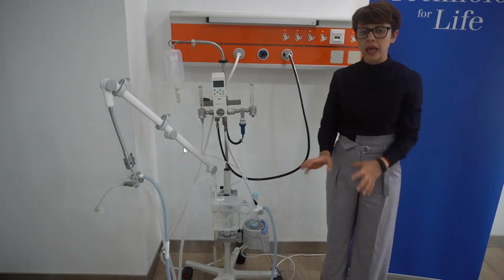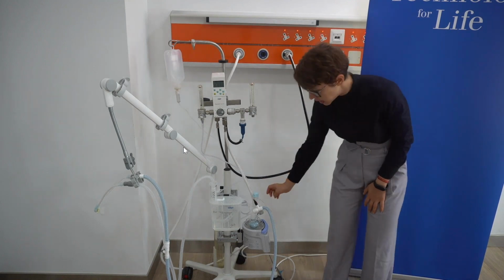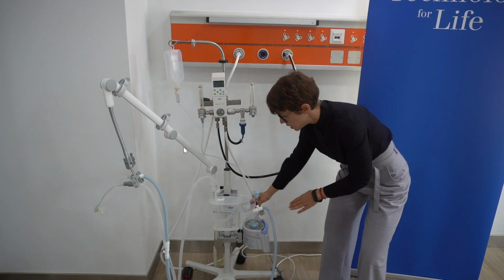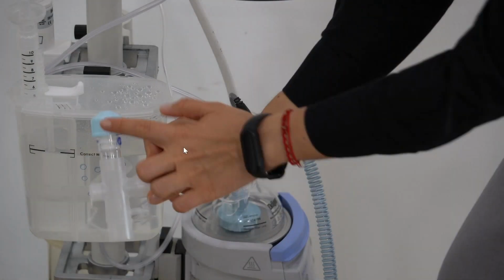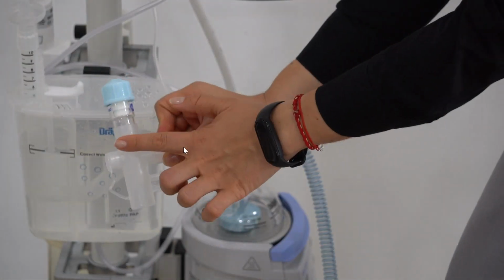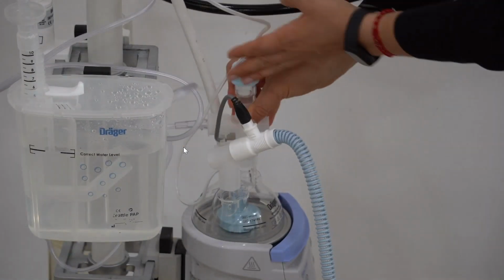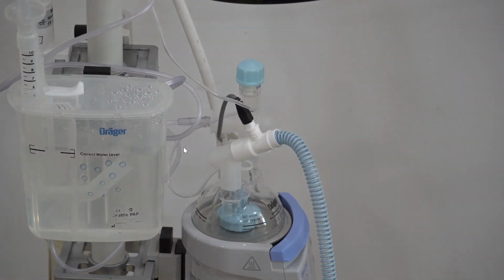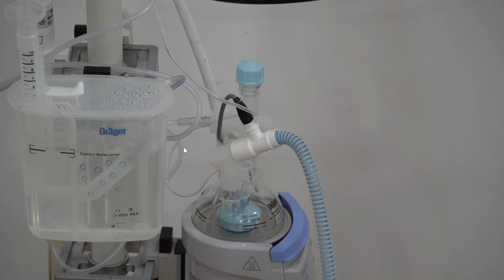During the normal operation, the valve is always closed. It comes basically as a setup like this, so I can show it to you in detail. You don't open it or close it. You just connect it to the humidifier here, and then you don't touch it. In case the pressure in the system builds up, the valve will pop itself, so it will open itself in order to release the pressure, and then it will close back once the pressure goes down.